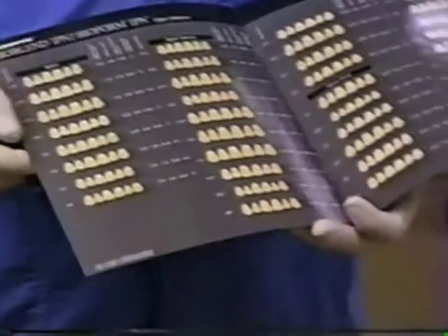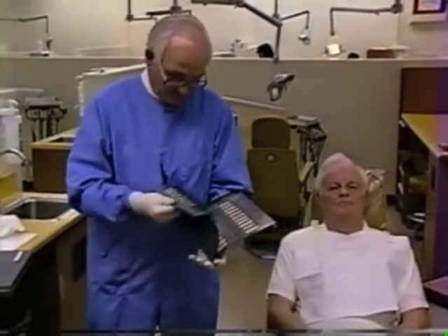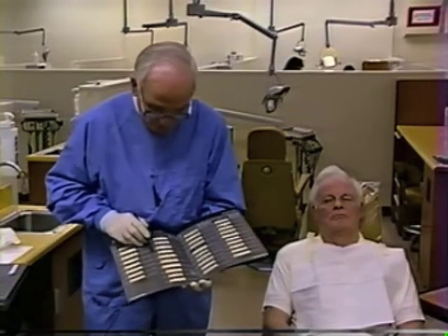My judgment is that 21C is a little small, so I'm going back to re-check the measurement. Looking again, I'm reading eight and a quarter to eight and a half — that's a little more like it. Going back to the square tapering section, let's look for eight and a quarter to eight and a half. Here's an eight and a quarter, which is 21F.